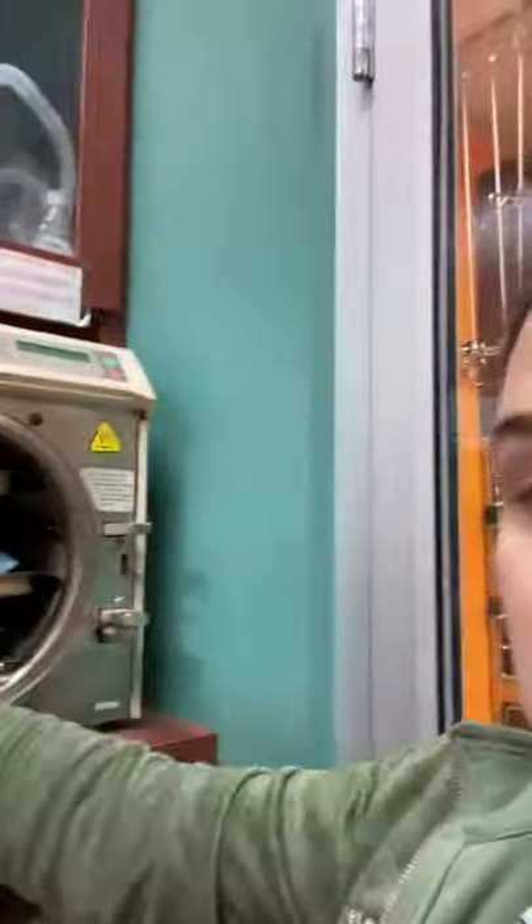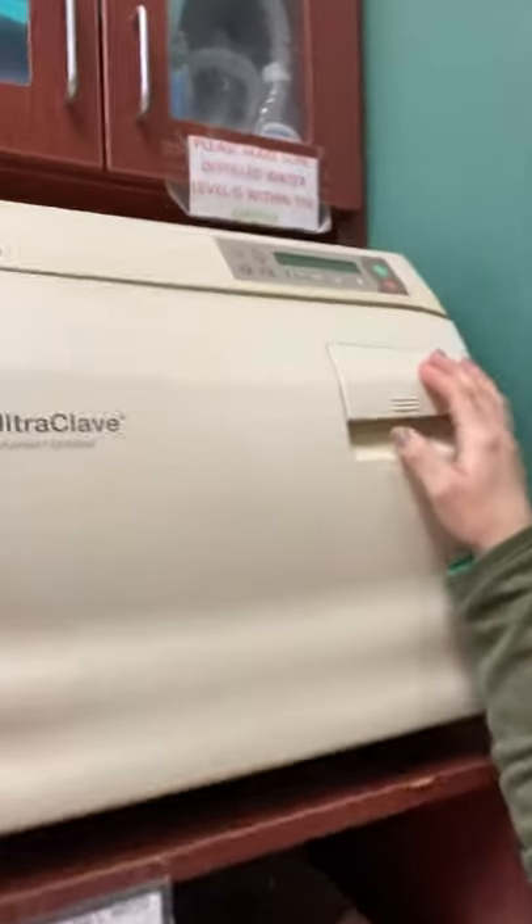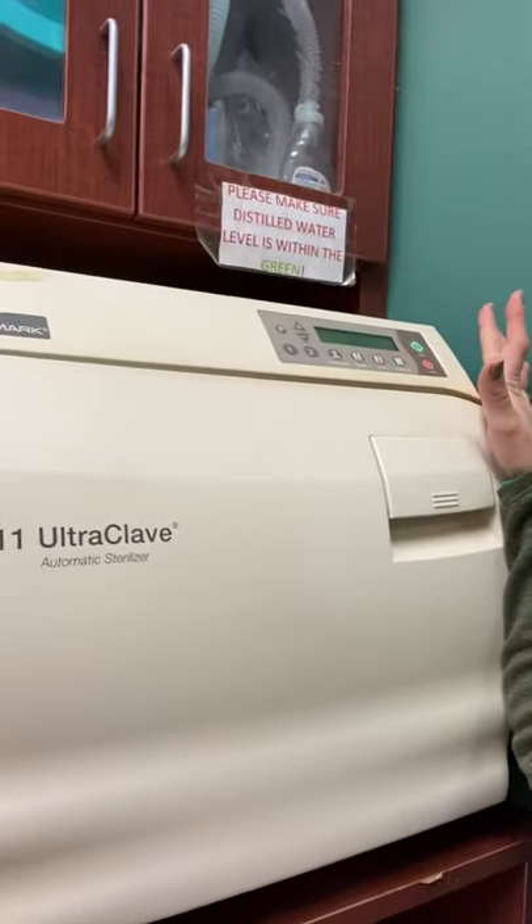With enough distilled water confirmed, we lift and lock it in. We come up to where it says 'packs,' hit packs, and then we hit start. Our autoclave automatically starts for our sterilization.